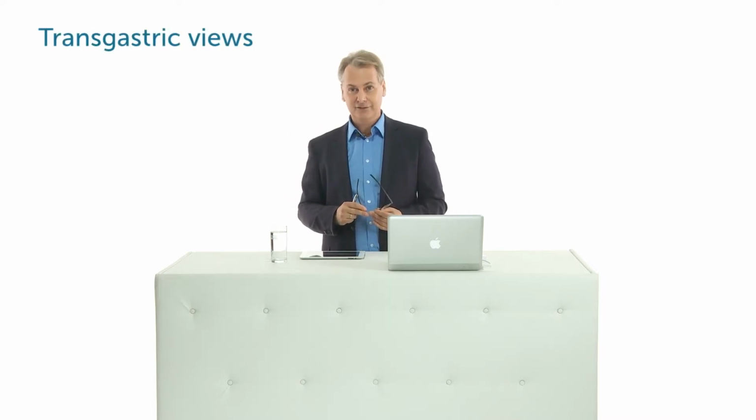So you see, the aorta is a very important part of transesophageal echocardiography, and as already mentioned, I would perform a view, or at least some views of the aorta in all patients. Rarely would we introduce the TEE probe deeper into the stomach to perform so-called transgastric views, at least not in our patients. But this is more frequently done in patients who are under anesthesia and where the discomfort of this procedure does not really matter. And especially anesthesiologists love these views because they help us to look for left ventricular function. Let's see how we get there.